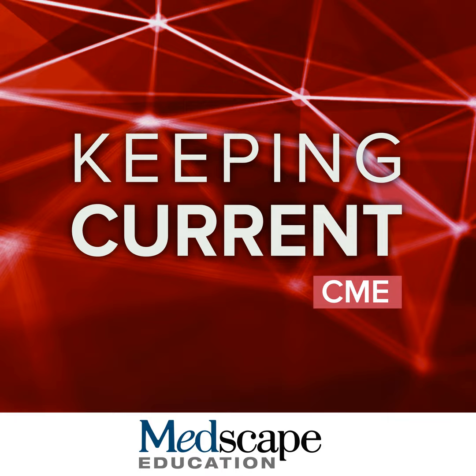For the MRI, this is new and has changed, because the therapies have a problem of something called amyloid-related imaging abnormality, or ARIA. The patients on therapy can get vasogenic edema, and they can get microhemorrhages, and they can also get small subarachnoid hemorrhages that manifest as siderosis on the MRI. So because of those particular findings that we're going to be looking for during therapy, we need to make sure that our dementia MRI protocols have the right sequences in order to identify those findings.